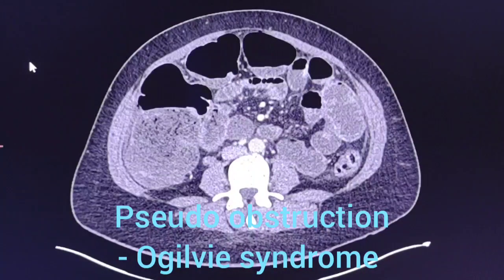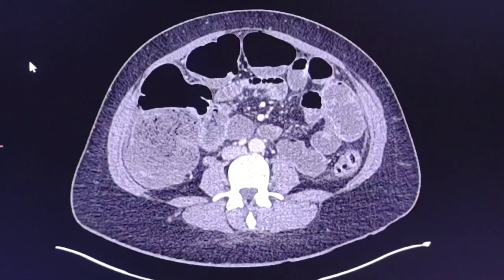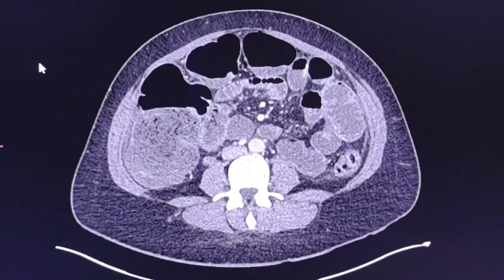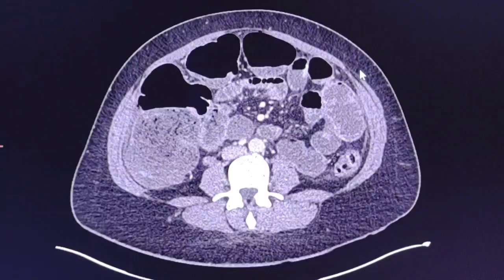This is a case of a 22-year-old female patient, day one post-caesarean section, who readmitted with severe abdominal pain and vomiting and not passing flatus. There were some dilated bowel loops on abdominal X-ray and the query was ileus, pseudo-obstruction, Ogilvie syndrome.